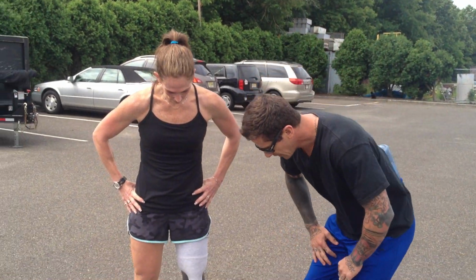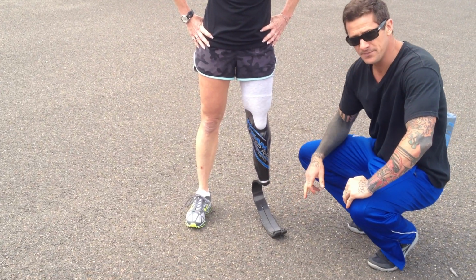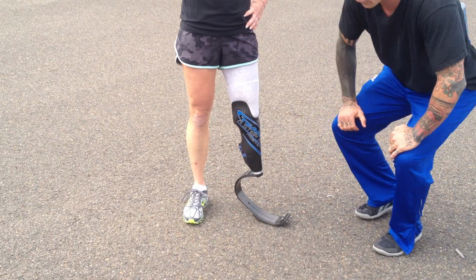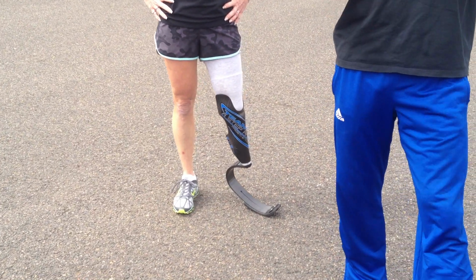And she is headed to Badwater this year to run the world's toughest ultramarathon. So this is one tough little lady, and what we just did was we actually corrected her foot position with her right foot. And as you can see, the prosthetic that she runs in is in this C shape, and it allows for what the ankle and foot and knee should be doing, which is muscle tendon elasticity when ground reaction occurs.